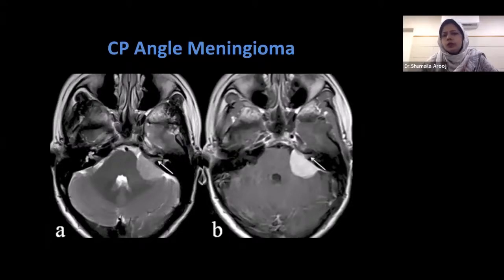If you start focusing and scrutinizing the images in depth, you start finding multiple things. Because eyes can't see what the mind doesn't know. If you have it in your mind that there can be some syndrome in this patient, and you try to look for that, you will find things.